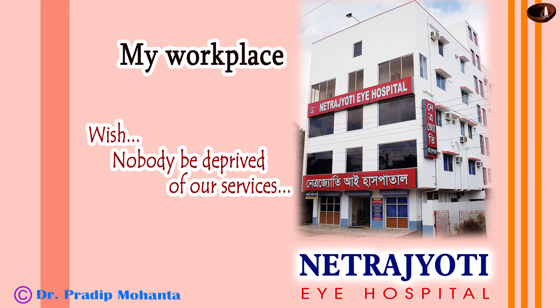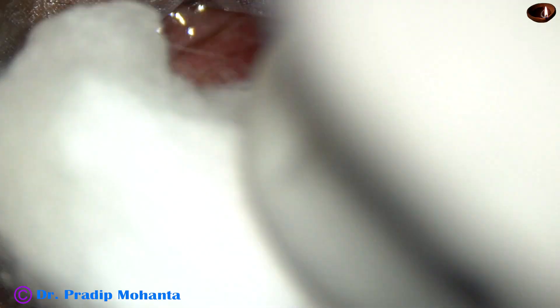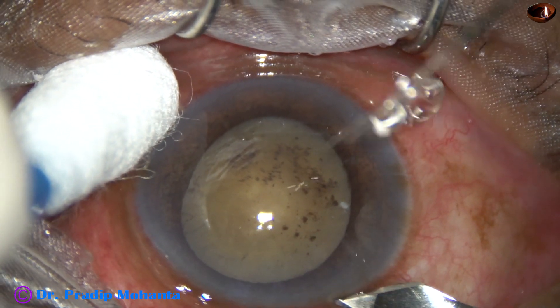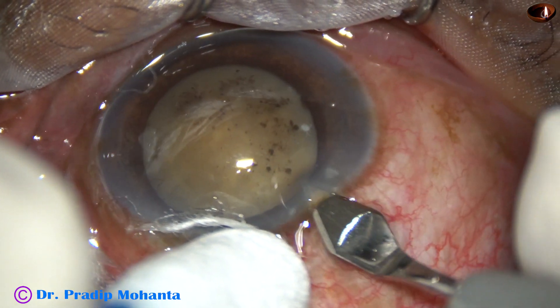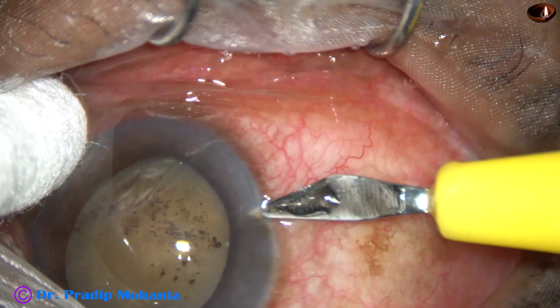Friends, welcome to my workplace at Ranaghat, West Bengal, India. This is a hypermature morgagnian cataract. The patient had an attack of phacolytic glaucoma, which was treated elsewhere. The patient has come to me with this appearance. There are pigments on the back surface of the cornea and over the anterior capsule. I have taken up this case for surgery. Let us observe the surgical steps.